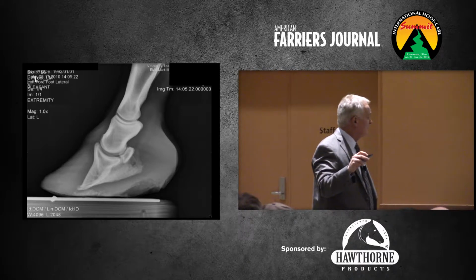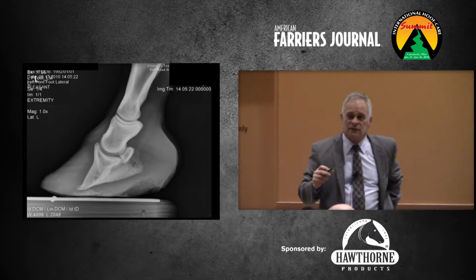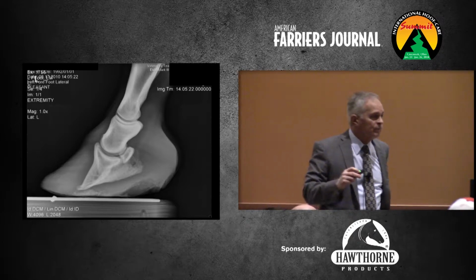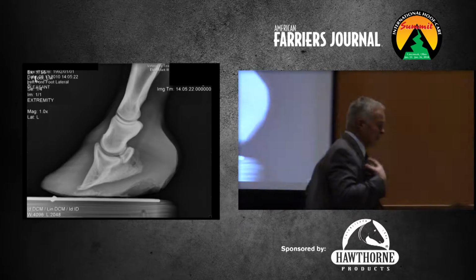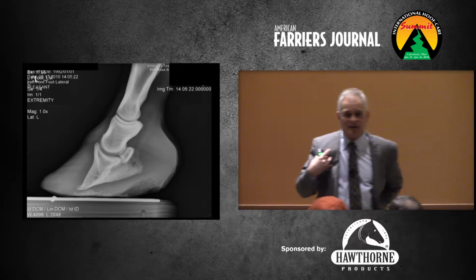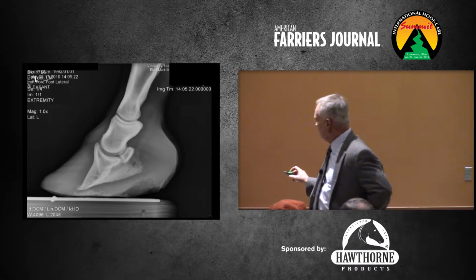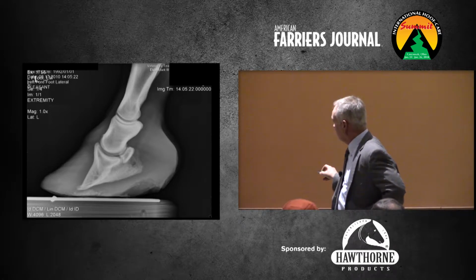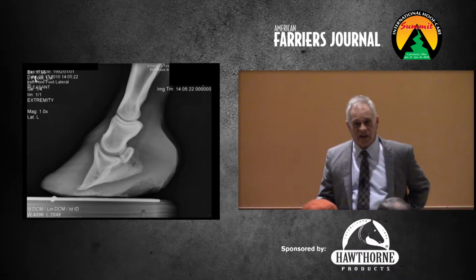Okay. So, again, what would you do with this one, just as curiosity? Yeah. So, again, I'll just say we've learned the hard way. Be really careful with these because you never know quite what's going on with them. And you don't want to be the big hero and take all that off and all that off and then the bone fall through the bottom.